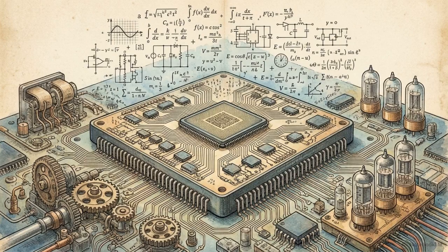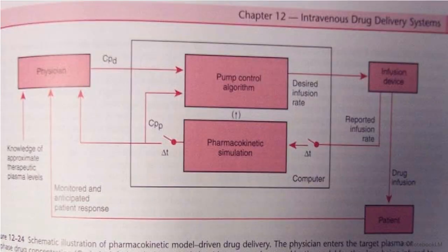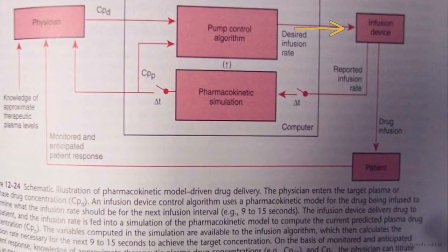To achieve a steady state in the patient, the TCI microprocessor must continuously solve for all of these moving variables simultaneously, recalculating the infusion rate every 10 seconds. Looking at this closed-loop feedback schematic, the inner control loop constantly compares its internal simulation against the physician's target. To hit a new target, it executes the bolus, elimination, and transfer scheme. Step 1. Administer an immediate bolus to fill the central V1 volume.